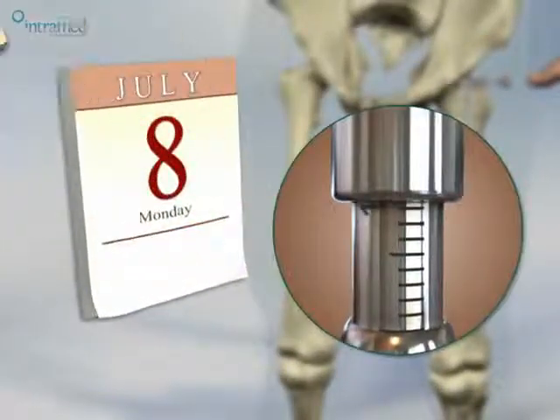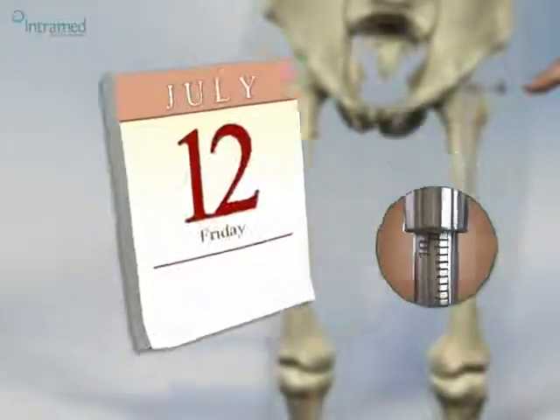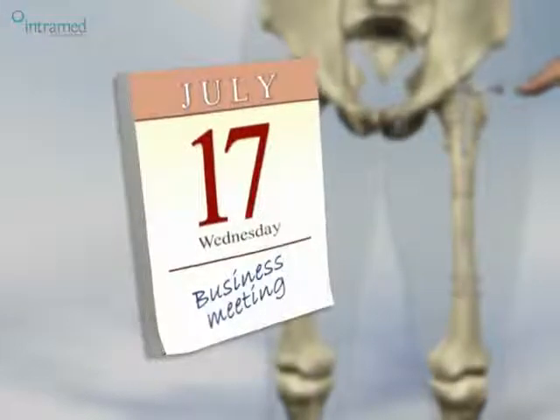Thanks to its robust engineering, simple activation and superior controllability, the Impress allows full return to daily activities.